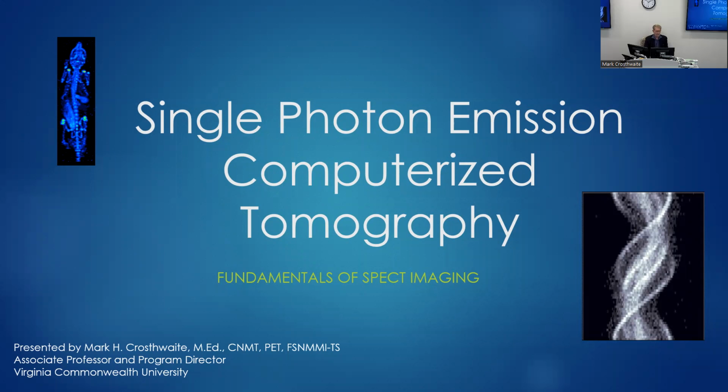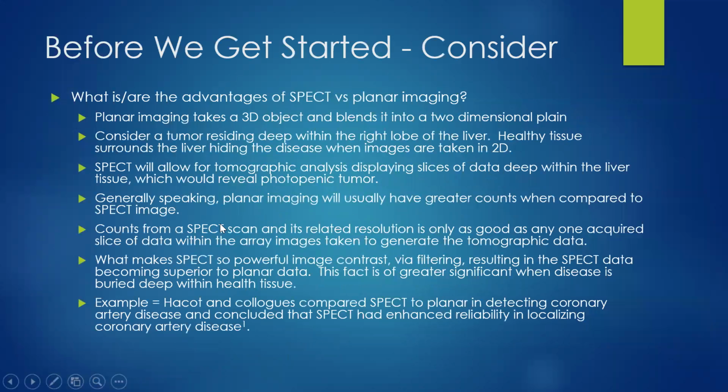Today's topic is going to be on single photon emission computerized tomography, also subtitled Fundamentals of SPECT Imaging. So before we get started, I'd like you all to consider a couple of things. To start off with, I'd like to compare SPECT versus planar imaging.